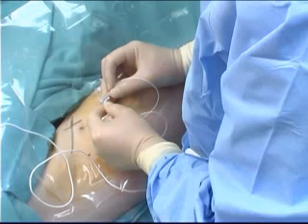Make a small adjustment to the needle by rotating it 1/4 turn clockwise or counterclockwise, or by withdrawing or advancing the needle slightly, and again advance the catheter. Repeat this maneuver as many times as is necessary to ensure correct and accurate catheter placement and successful secondary block. In young, healthy, fit adults, this may require many attempts, and patience is usually required.